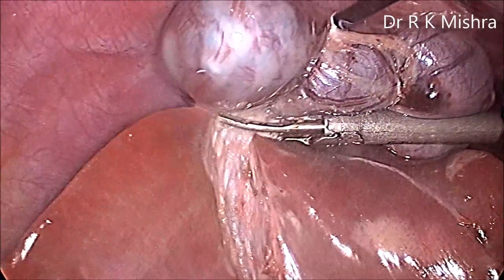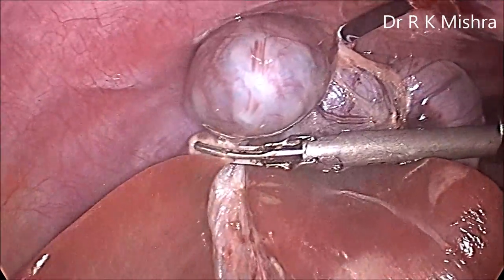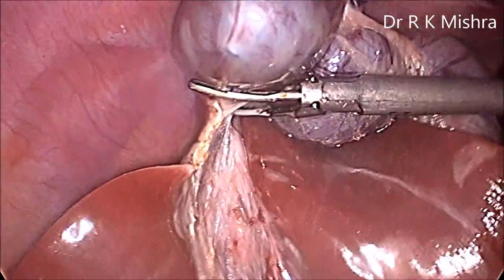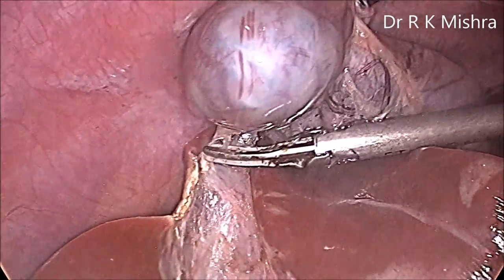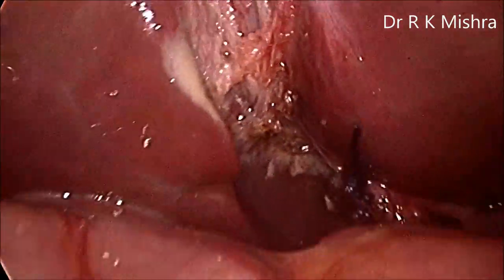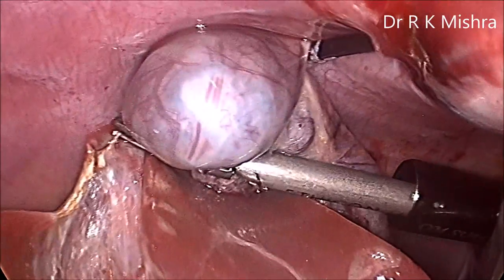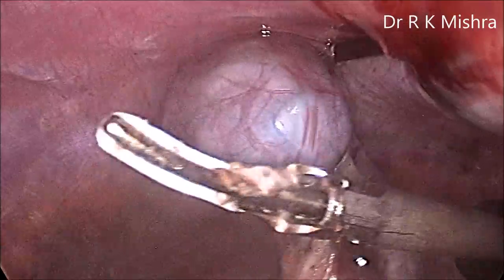In my opinion, two-port cholecystectomy is better than single-incision. The patient has less pain, early recovery, and no scar is observed. Before taking out the final part of the fundus, one good look below is advisable to confirm everything is fine. The light cable was down and is now up; no bleeding, everything is clear and dry. Then separate the final part of the gallbladder. This is how cholecystectomy can be done with only two ports and one percutaneous instrument — the Striker mini alligator.